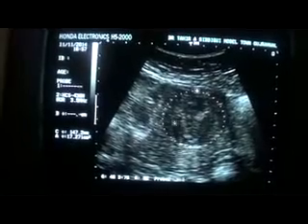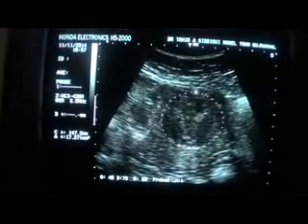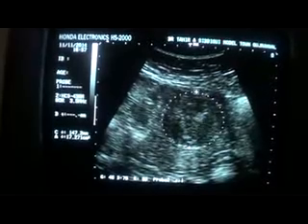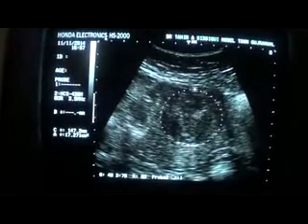These cystic areas with echoes are consistent with internal degeneration or necrosis within this fibroid. This is a magnified view. You can see there are multiple tiny calcifications — the larger one is this.